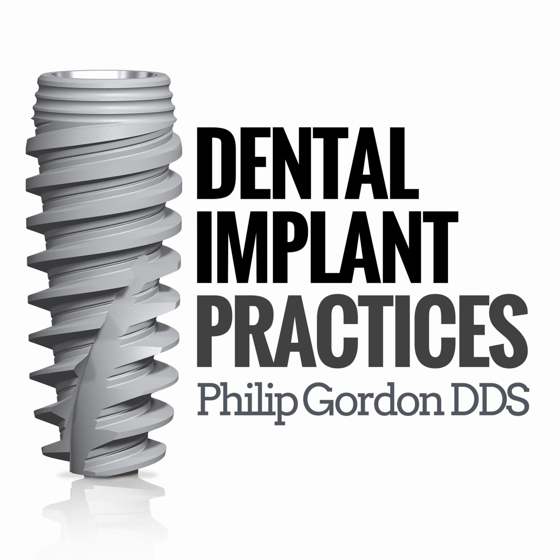And then at the end of the morning or the end of the day, we finalize the plan and get it uploaded so that we can have the surgical guide made. So it's a very simple workflow. We get the guide back, and then, of course, we use the surgical guide for directing our implant placement. And when we use the guide, not only is it more accurate, but it's more efficient.